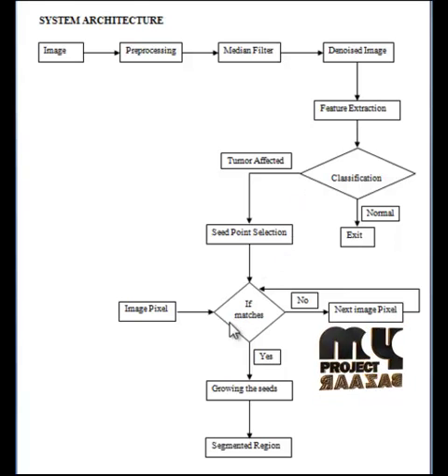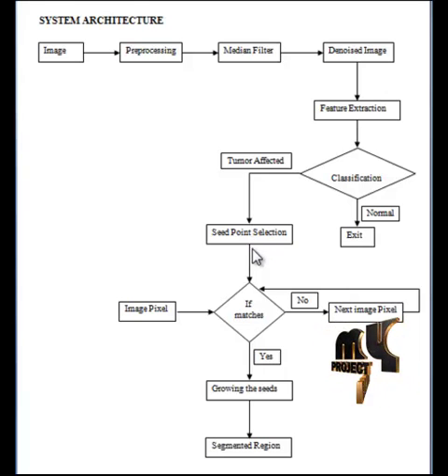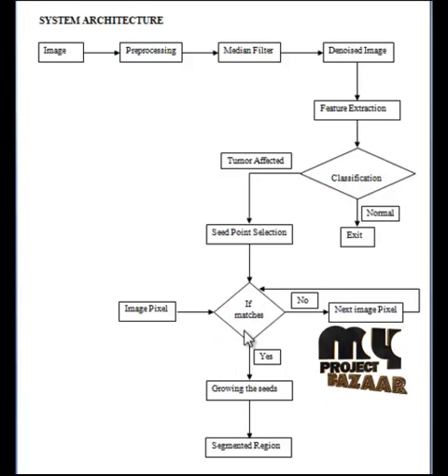In the first step of region growing, the seed point is selected. The seed point is selected based on the user criteria. The initial region begins at the exact location of the seeds. The regions are then grown from the seed points to the adjacent points depending on the region membership criterion. The criterion could be, for example, pixel intensity, gray level texture or color.